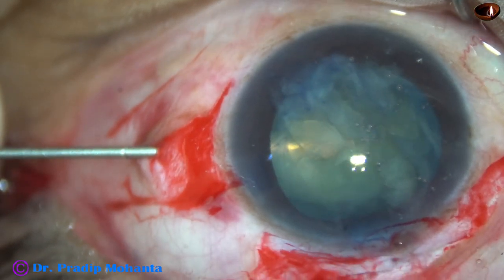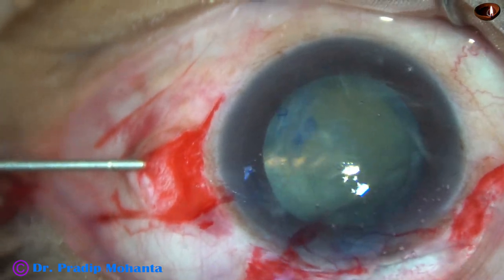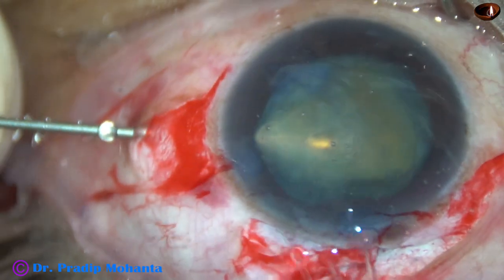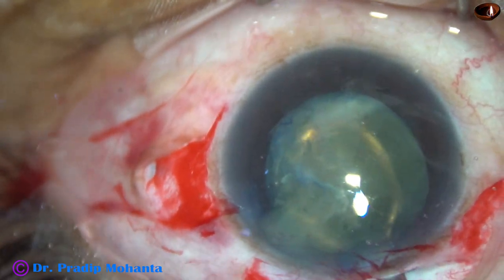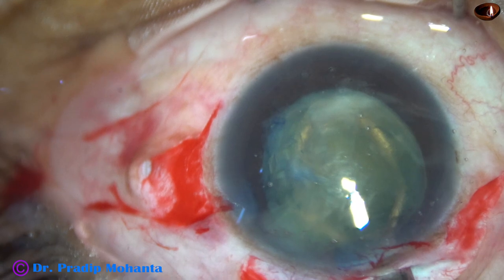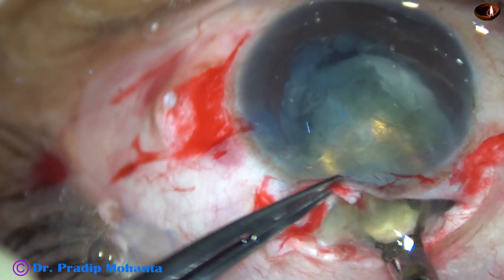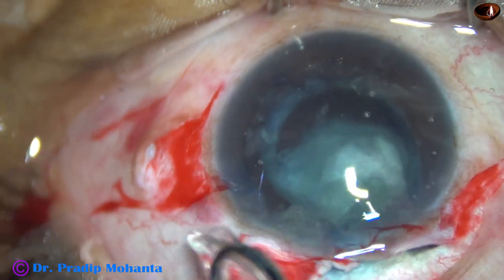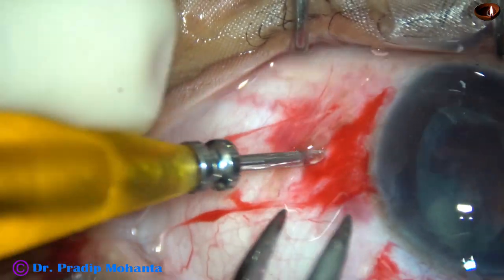Now my plan is to use an irrigating vectis. I want to see the nucleus ahead — you can see the nucleus nicely. I go behind the nucleus with this small irrigating vectis, and now I remove the needle. I hold the anterior lip of the main wound with the toothed forceps, press the posterior lip, and very gently remove the nucleus. The nucleus was not very large, so it came quite easily.